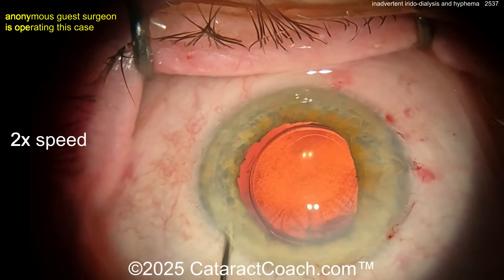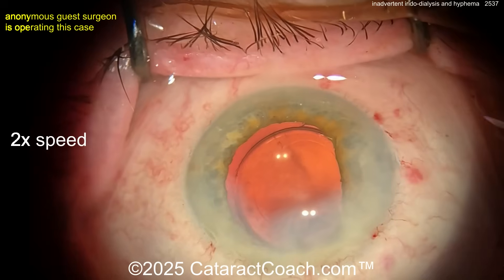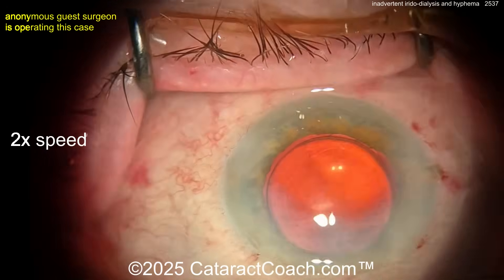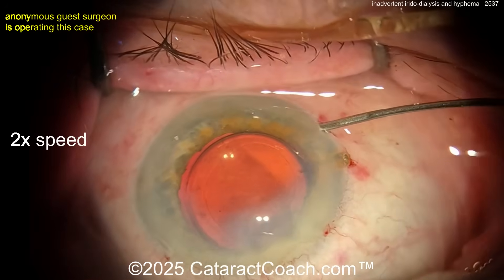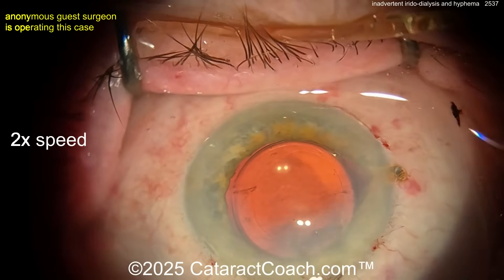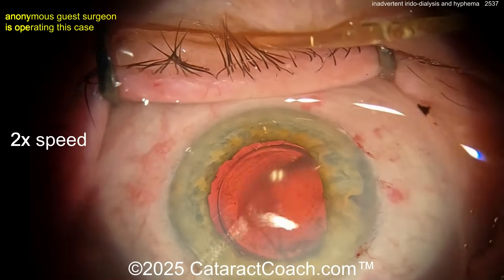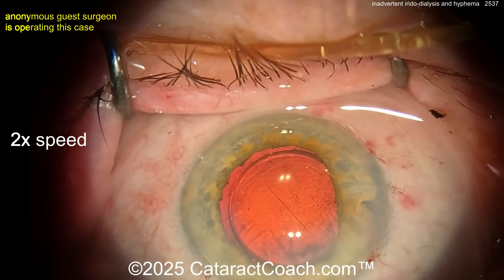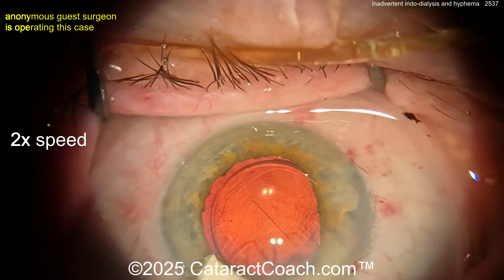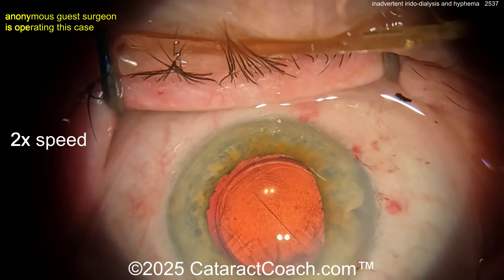Now look — there's iridodialysis there on the right side of the screen, a couple of clock hours. You can see the pupil now has a D-shape — like a backwards D — where the straight edge is the dialysis area. What do you want to do? Are you going to fix it now? I think the better part of judgment is to not worry about it today: finish the case, stop the bleeding. The dialysis should be repaired, but it's easier to come back and repair it at a second sitting.